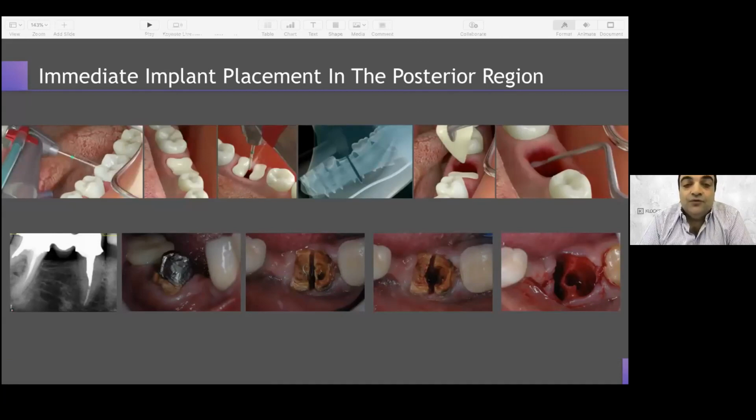Really, these two roots will help in doing our preparation. It's like drilling in a healed ridge, and we don't extract the root before finishing our preparation. We finish our preparation, we do the root extraction, and we do our curettage, and look at our preparation.